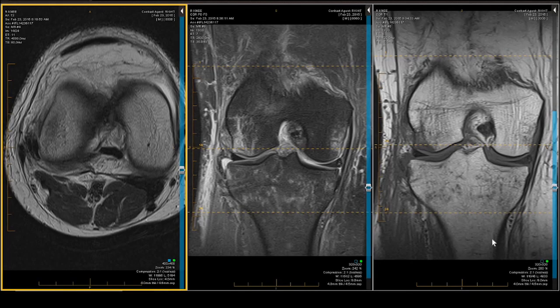A 54-year-old man reported a few days ago that he had a twisting injury and now he can't bear weight, has limited range of motion and swelling. We're interested in the corners, so let's look at the axial projection first.